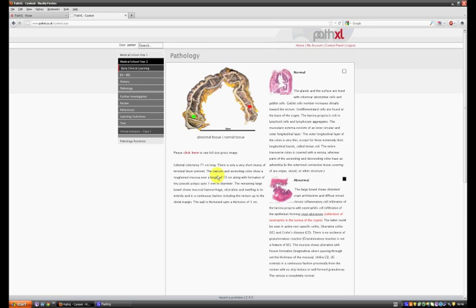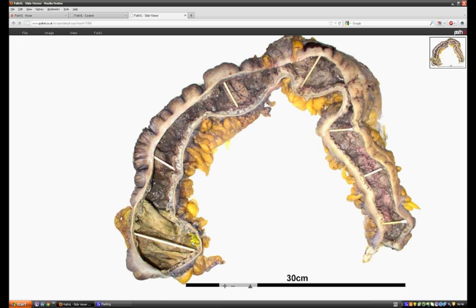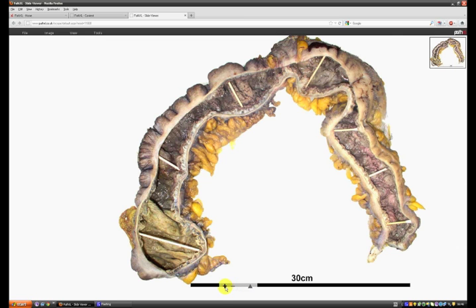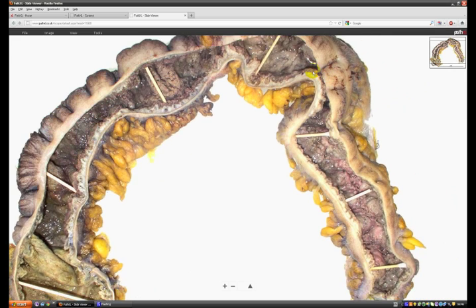This page is about inflammatory bowel disease, with macroscopic images of a colectomy specimen, a description of that macroscopic sample, with detail of the underlying pathology of normal and abnormal mucosa. Under course creation, this can be configured in whatever way you require. The gross image can be viewed, again using the same viewer as virtual slides, and moved around and enlarged as necessary.